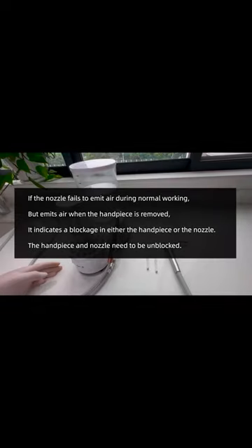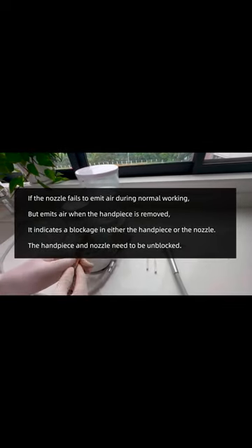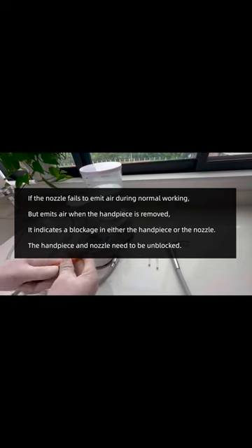If the nozzle fails to emit air during normal working, but emits air when the handpiece is removed, it indicates a blockage in either the handpiece or the nozzle. The handpiece and the nozzle need to be unblocked.